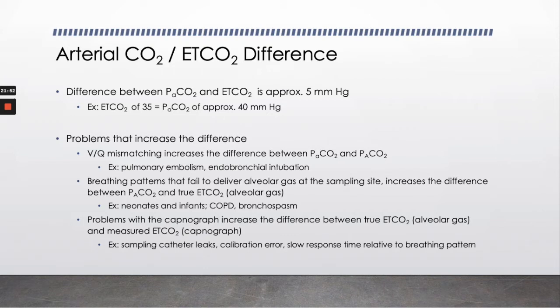This is a very extreme example, but it could happen, because some of these things have happened in the past. So there's perfusion on the left lung, but no ventilation over there. That would be the increase in shunting.